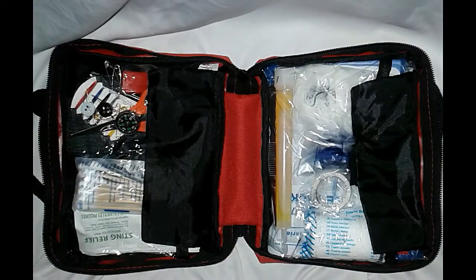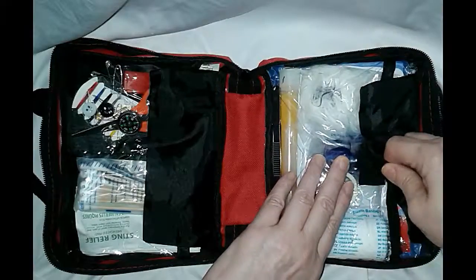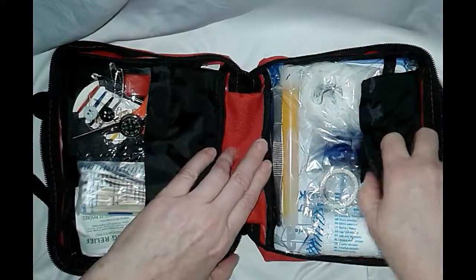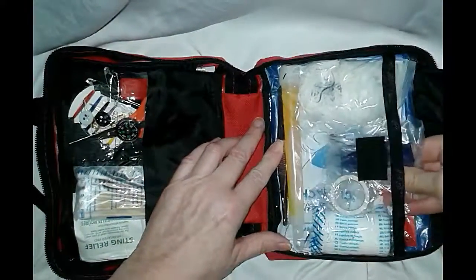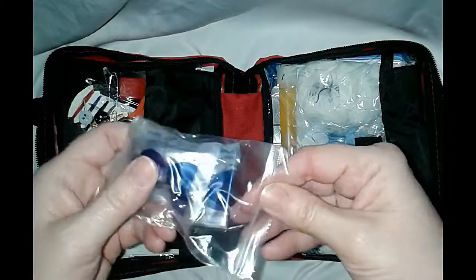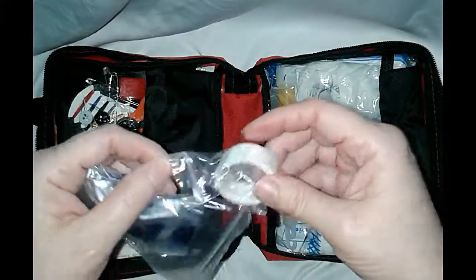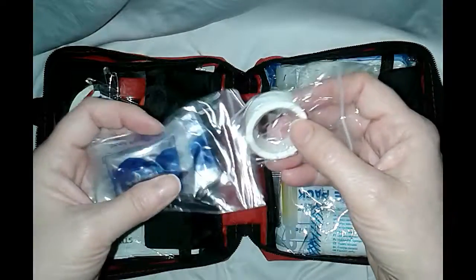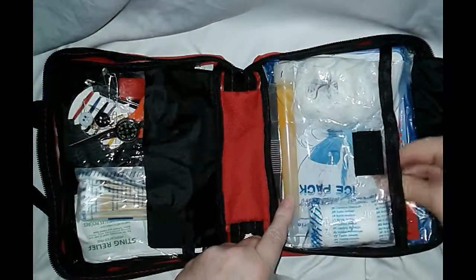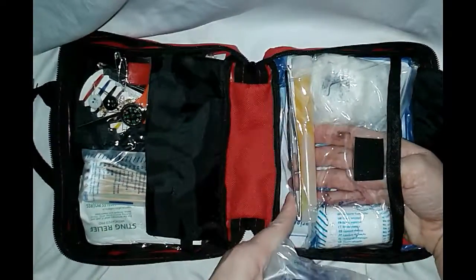It's got a velcro holding on this side — nice. Inside, I'm not going to unpackage everything because you can read on Amazon exactly what's included. Everything, as you can see, is in its individual protective packaging, which is really nice. My last first aid kit was just thrown in there and every time you'd go to use something you had no idea if it was sterile or clean.